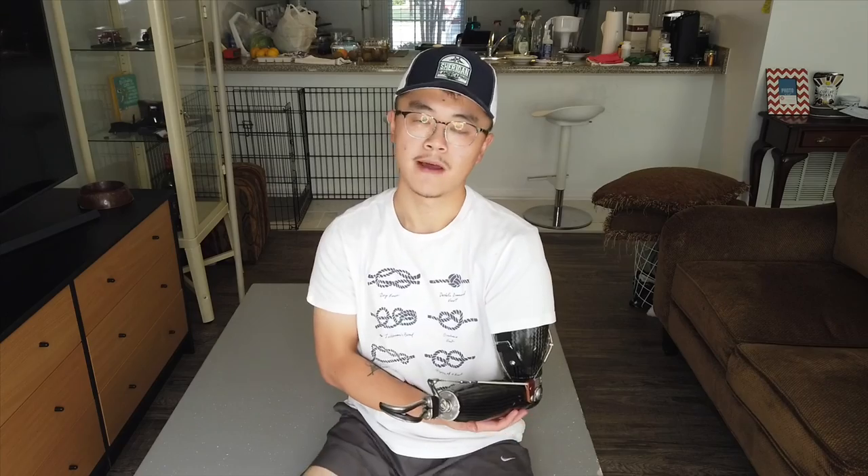Hello everybody, welcome back to another video. I have gotten plenty of questions about how does my prosthetic arm work — more specifically, my above elbow prosthetic arm, and how do I go about wearing them. So today I'll go into detail to talk about these questions.